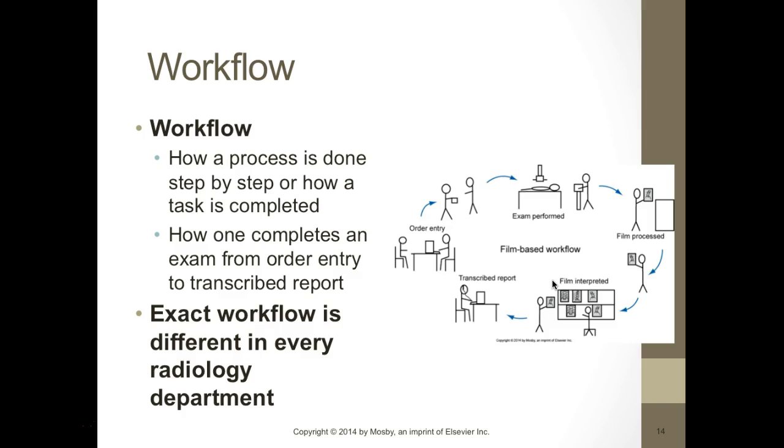The exact workflow is different in every radiology department, whether it's film-based or PACS-based. The workflow is totally different. So when we had film, this is a film-based workflow. The order would go in, the paper would be handed to the technologist, and the technologist would come get it. We'd perform the exam here, so that's us taking the image.